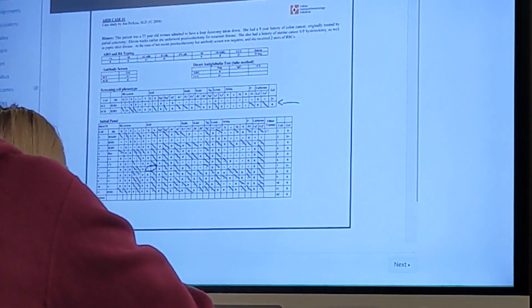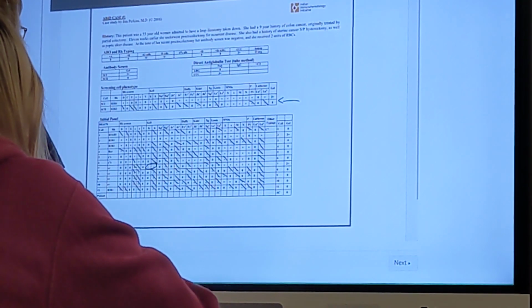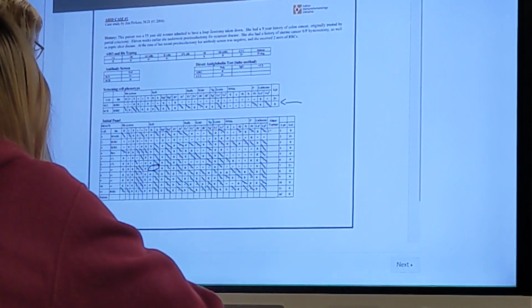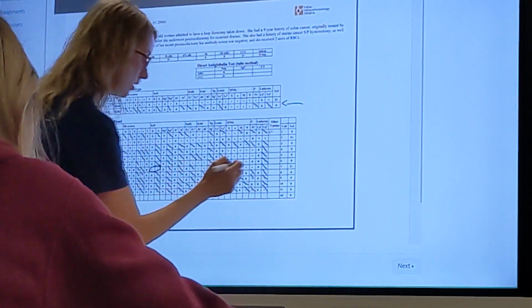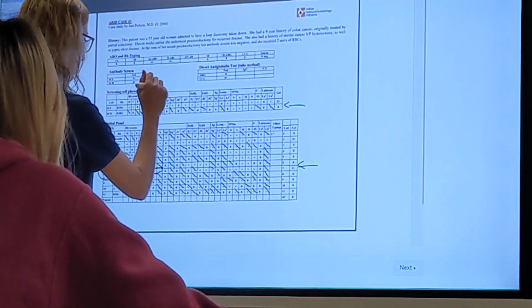Okay, I'm done. Okay, so what fits the pattern? K, anti-K, anti-big K. Oh, what I did. So my cell number 7, I wasn't supposed to rule out on, and I did. So don't do what I did. So Kell fits the pattern, right?